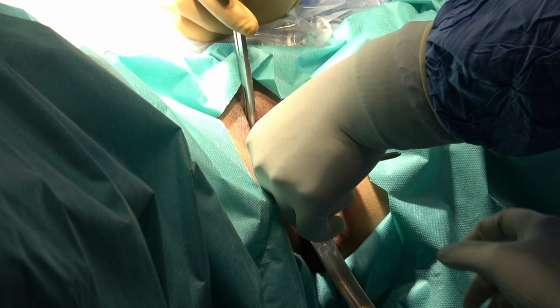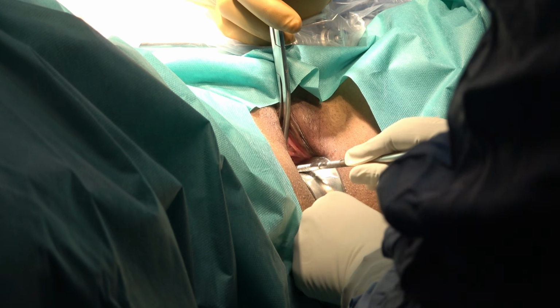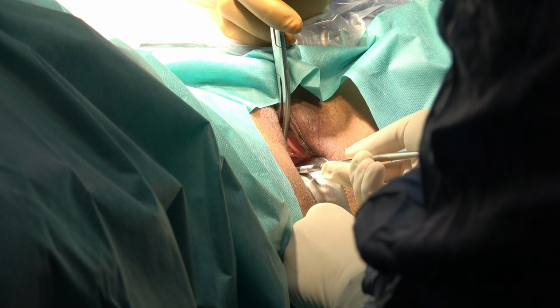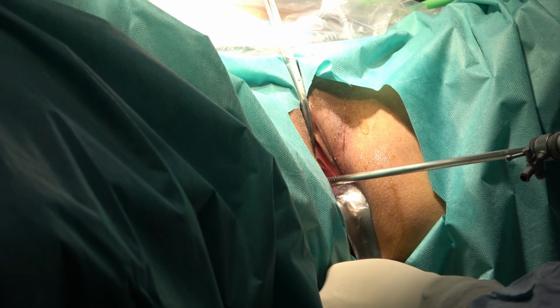And this is the Hager dilator, we will put it. And misoprostol we have already given 2 hours before the procedure in the OPD itself, and misoprostol is essential because it will make the cervix soft and then you can introduce the resectoscope.